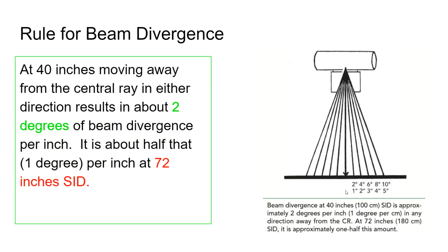So this is what we had talked about before. To a lesser extent, your alignment can also cause distortion. And this can happen in those very same hip x-rays, right? Because a lot of times you might not put the patient on the table. You might just get a slip-on grid or use the flat panel detector and just put it under the patient on the stretcher. It's certainly much easier in some cases when they're in a lot of pain and you don't want to put them onto the table. I try to get everyone onto the table. But if you didn't, you could certainly have your alignment off.